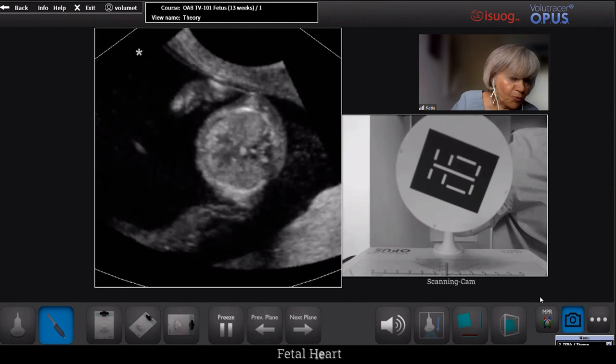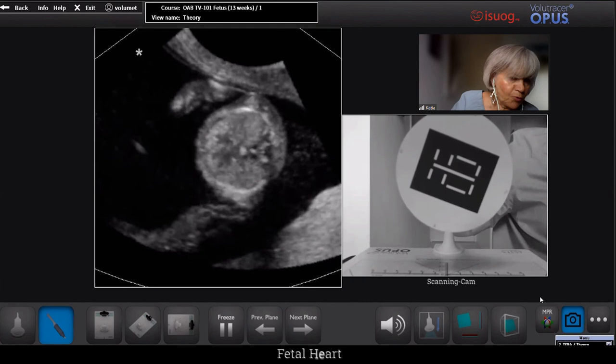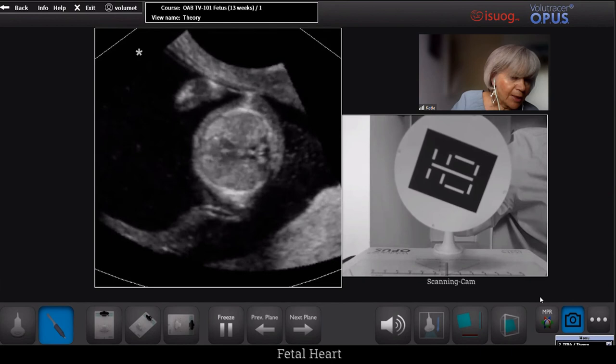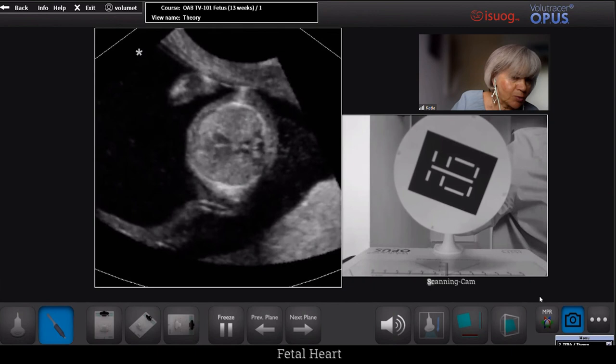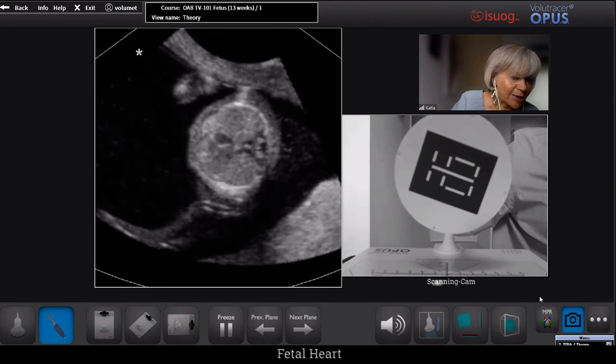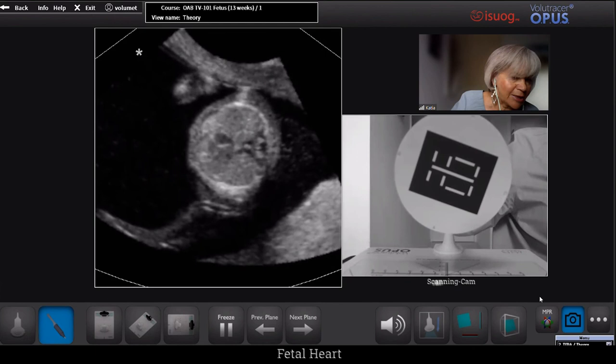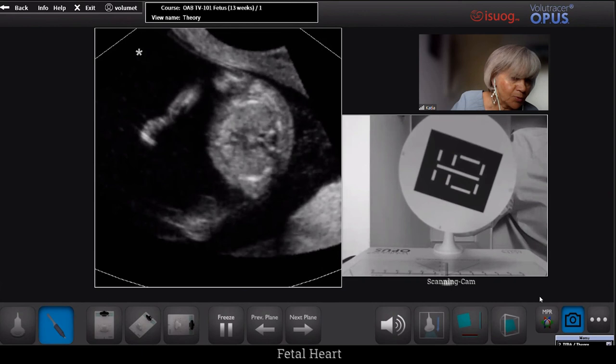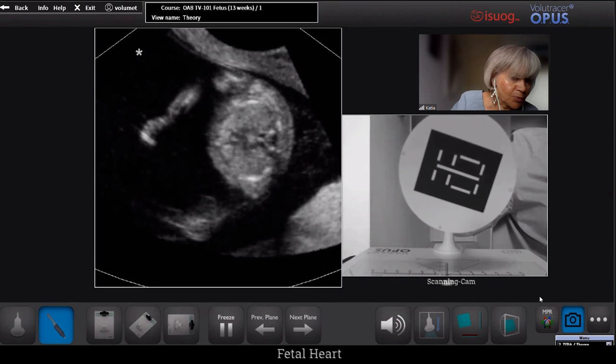Going higher up, we fall into the four-chamber view. This is not a perfect four-chamber view because the quality of the picture is very much dependent on the quality of the volume. But we see that there are two AV valves, two cavities — the two atria and the two ventricles. We cannot say anything about the integrity of the interventricular septum, but we can obtain very nicely the three-vessel view — three vessels aligned, as you can see here.